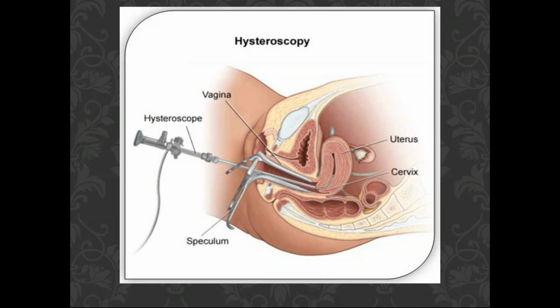The hysteroscopy indications may be diagnostic as well as operative: transcervical resection of myomas, polyps, taking biopsy, endometrial hyperplasia, unexplained bleeding, postmenopausal bleeding, Asherman syndrome treatment with adhesiolysis.